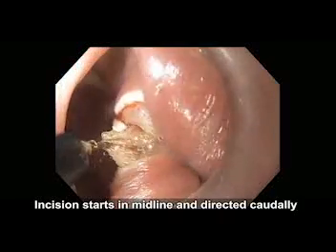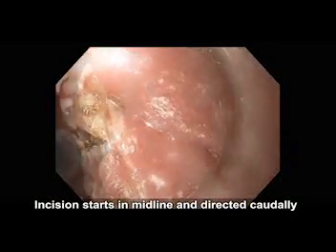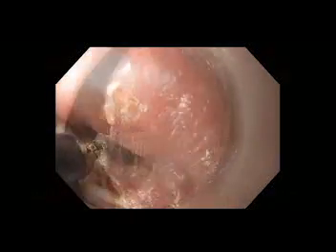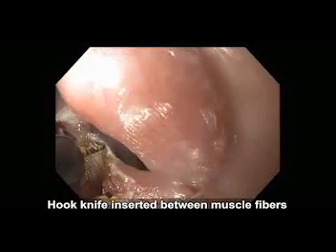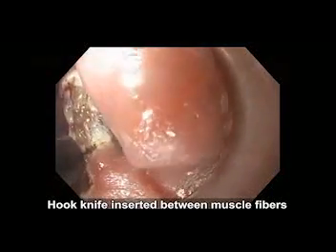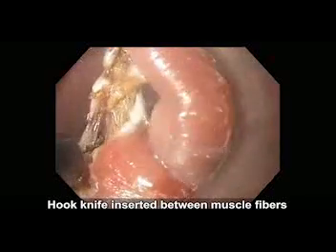The incision is started in the midline and directed caudally toward the inferior aspect of the diverticulum. As the cricopharyngeal muscle fibers are visualized, the hook knife can then be introduced between the individual fibers or between a bundle of fibers, and a controlled, stepwise incision of the cricopharyngeal muscle can be performed.